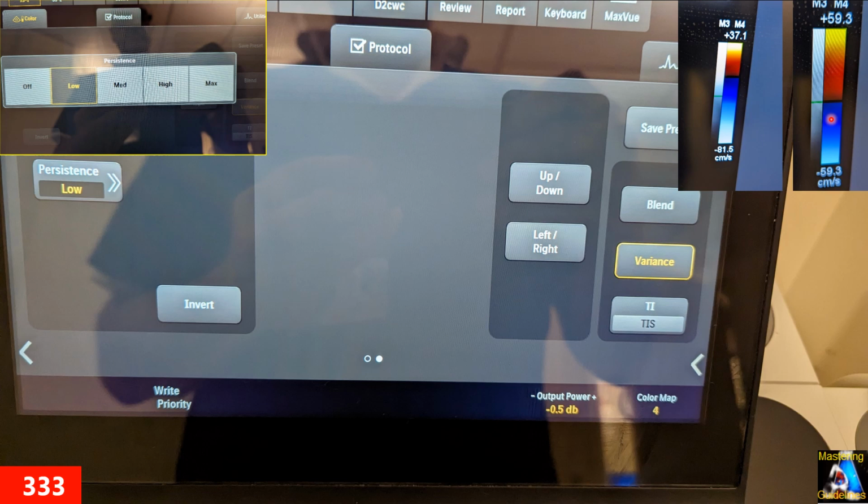So in those cases, especially lower extremity and in the neck, we change it sometimes. But don't forget, when we change it, always mention where the area is, because that is important for detecting any abnormal blood flow.